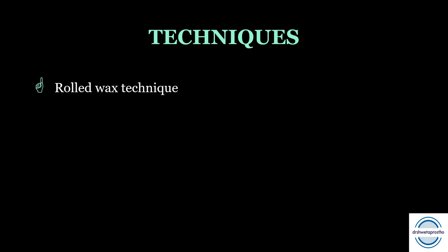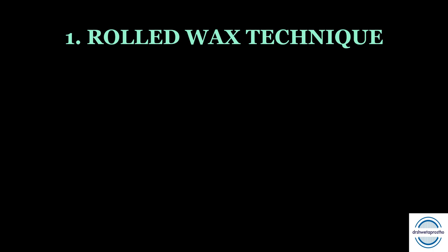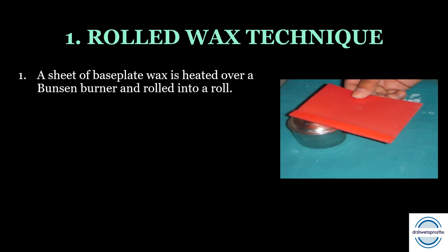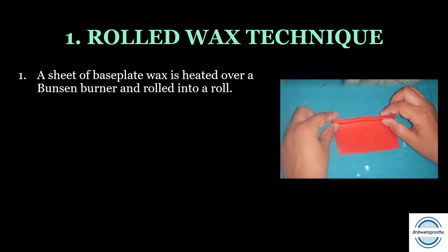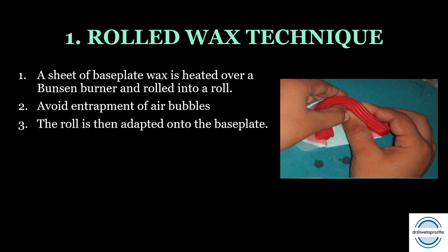There are three techniques to form occlusal rims: the rolled wax technique, preformed occlusal rims, and metal occlusal rim formers. The rolled wax technique is the most common used in preclinical exercises and clinics. A sheet of baseplate wax or modeling wax is heated over a Bunsen burner, rolled into a roll approximately four inches long, avoiding air bubble entrapment. The roll is adapted onto the base plate and shaped according to the arch form — square, tapering, or ovoid.